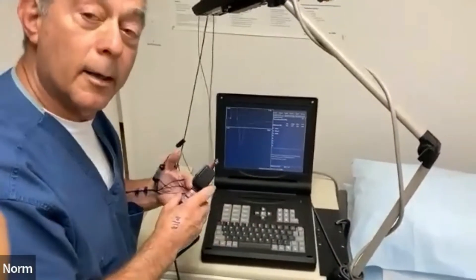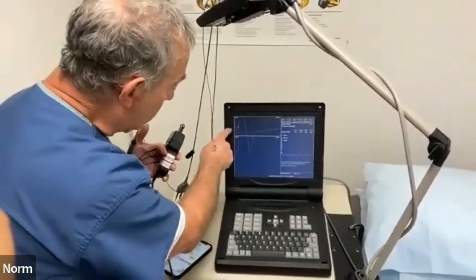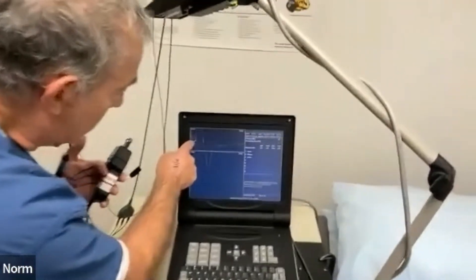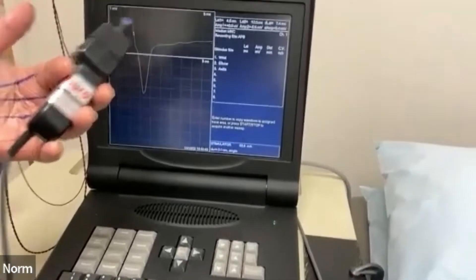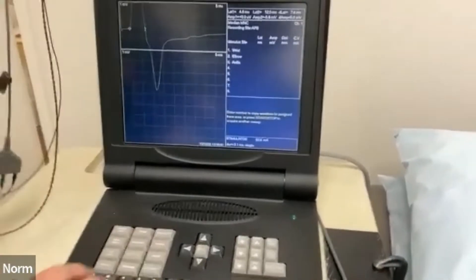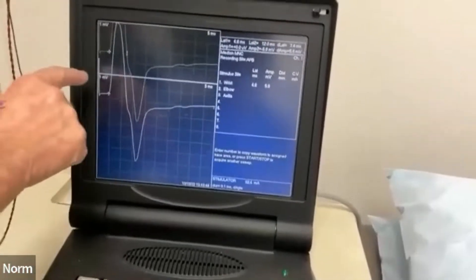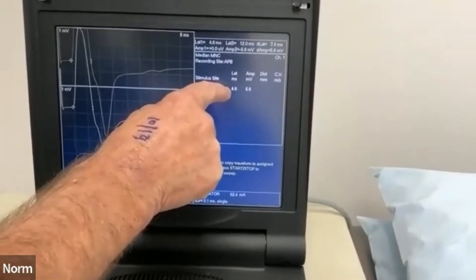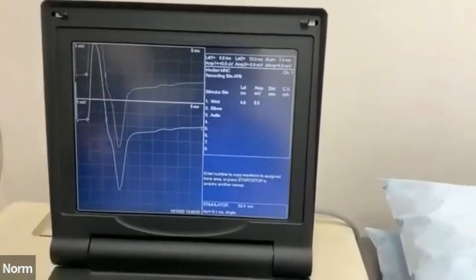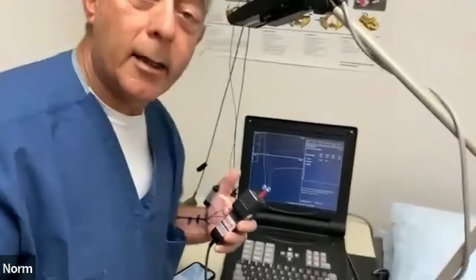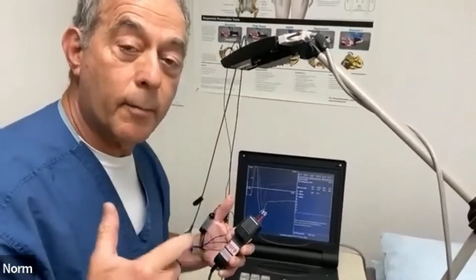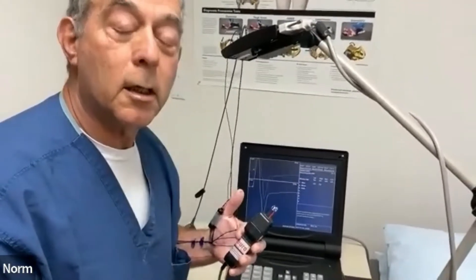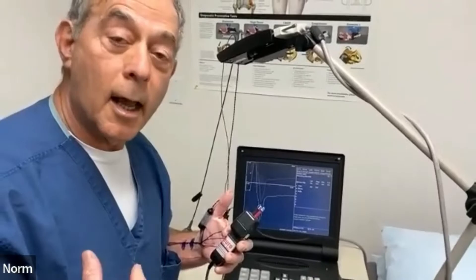I now have the ability to test to see if I have carpal tunnel. I'm going to see how long it takes to get from here to that little spot, where the action potential reaches the muscle and you have an upward deflection. I'm going to see what my latency is — and it looks like it's 4.6 milliseconds. That tells me that I have carpal tunnel syndrome. Latency is the time from stimulation until the time it's received by the muscle. If it's slow, it tells you that you've got carpal tunnel syndrome.